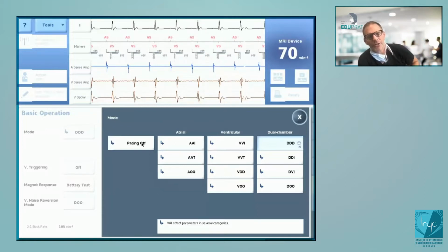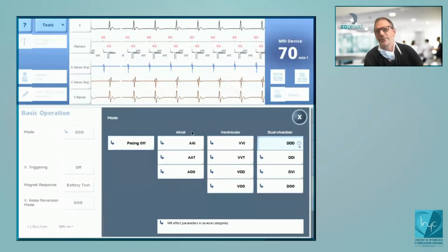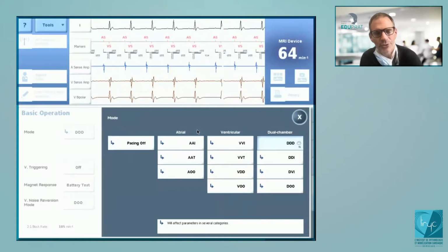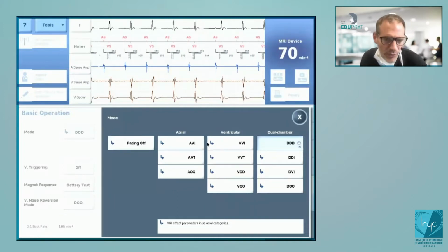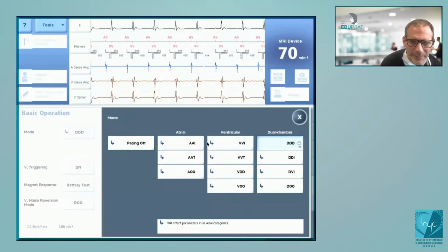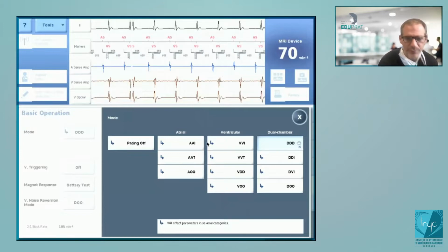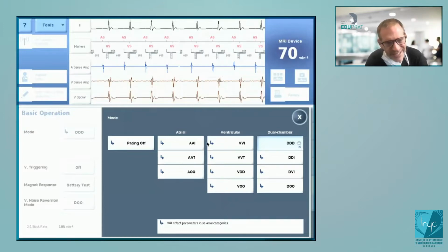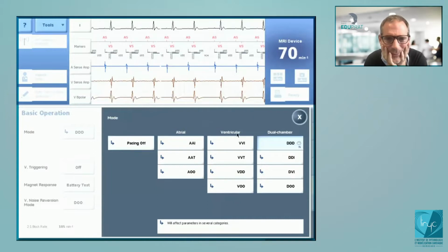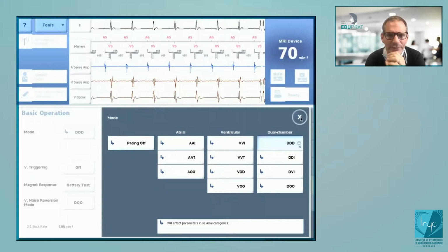Sometimes an epicardial pacemaker is implanted, and for any reason you want to implant a classical, traditional pacemaker with an endovenous lead, and you want to deprogram the epicardial pacemaker without extracting it. You have the possibility to program pacing off. But remember that at the end of service of the device, you may have a backup pacing VVI, 67 beats per minute. Okay, go out of this.